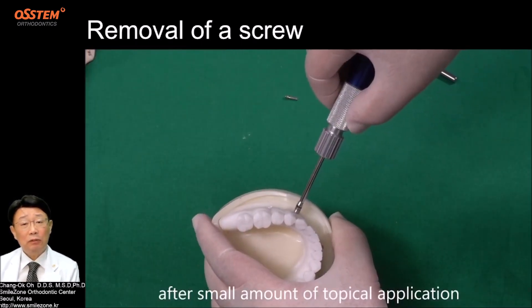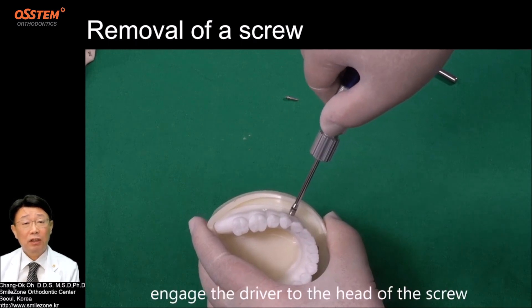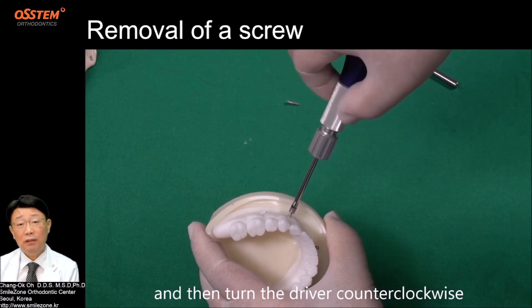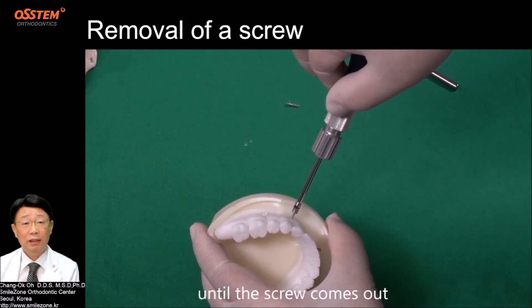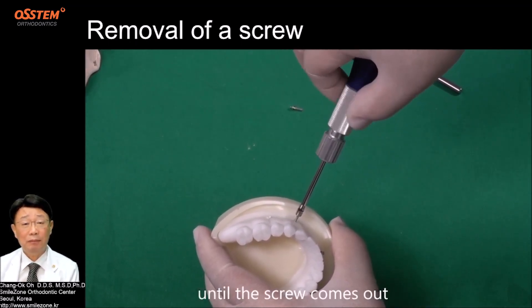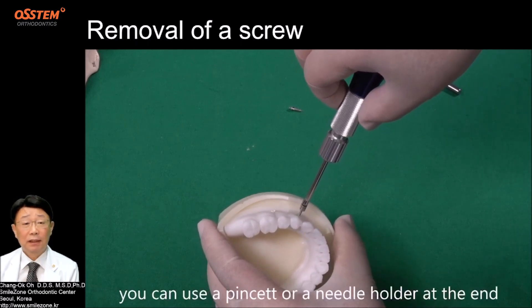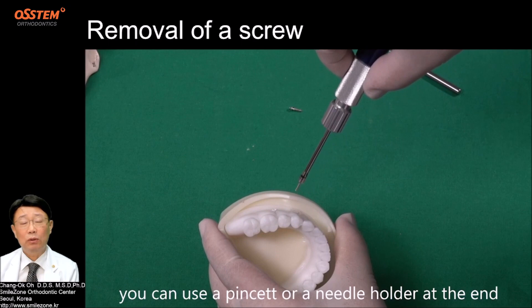After a small amount of topical application, engage the driver to the head of the screw and turn the driver counterclockwise until the screw comes out. Then pull out gently. You can use a pinset or a needle holder at the end.